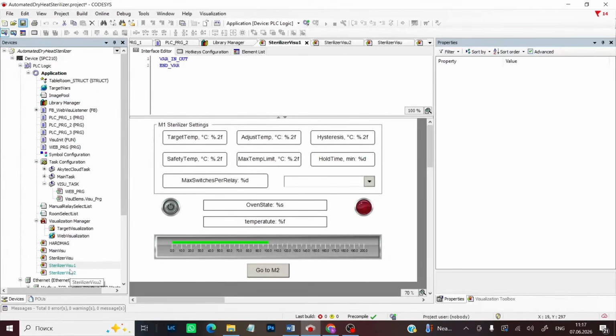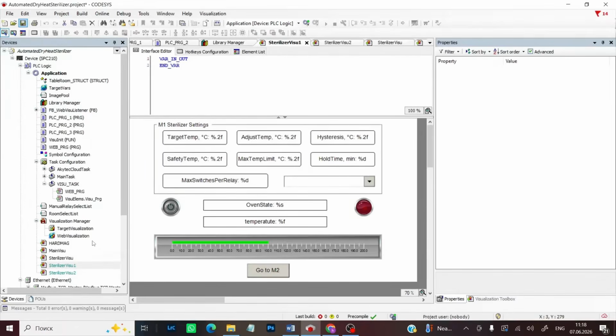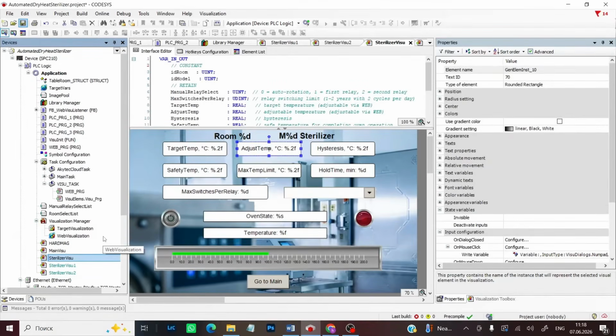But what we definitely can't accept is duplicating the user interface visualization files, since graphics are the main consumer of memory on any device. To solve this issue, for now, I excluded the old visualization files from compilation and duplicated the visualization components in the new file that I added to the project. Since the visualization interface is absolutely identical for any sterilizer model, you can use just one file for all 100 models instead of having 100 identical ones.